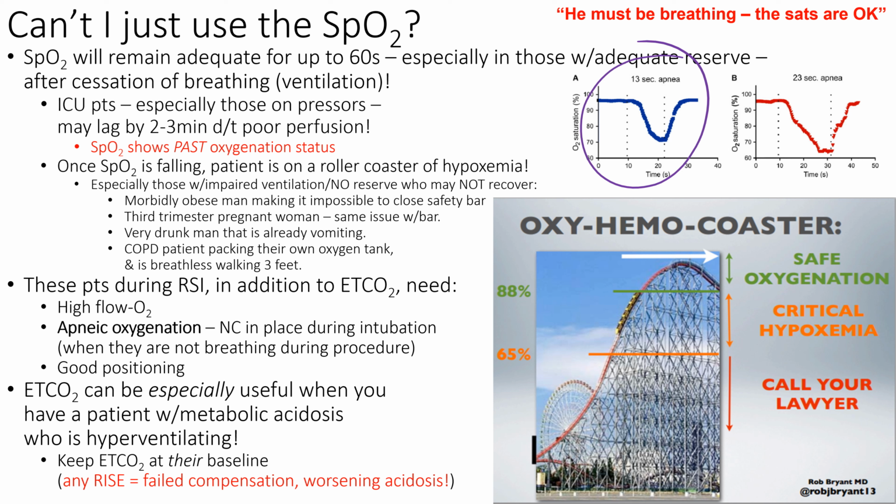Like a person has a 13-second apnea period, right? I'm not sure if you've ever watched someone breathe at night, on a night shift. It's like, why are you watching me sleep? But anyways, you watch them and you see they stop breathing because they've been snoring for a storm beforehand, and then you see your pulse ox, and it won't be till 13 seconds, sometimes 20 seconds later before they kick back in, and it triggers them to take another breath, right? Hypercapnia or CO2 actually will rise first and will trigger your brain to fire off more than oxygen will, right? So you can't use pulse ox reliably in that situation.